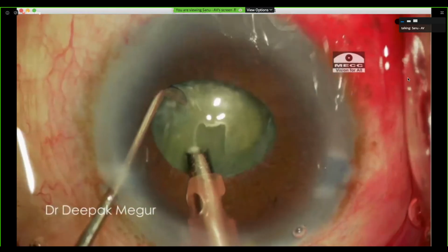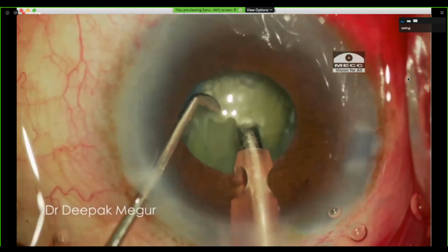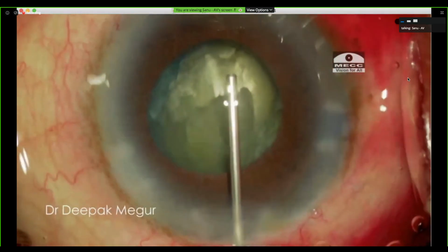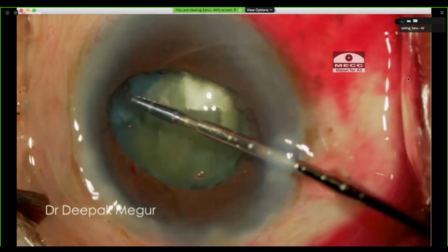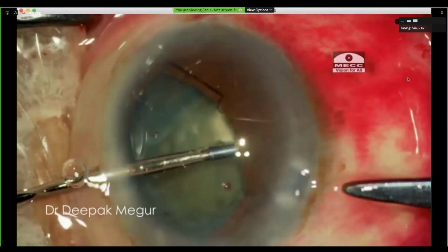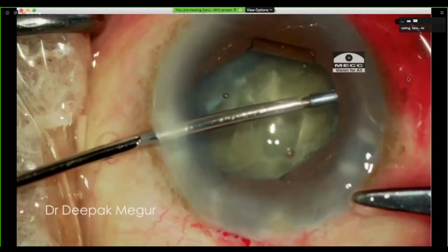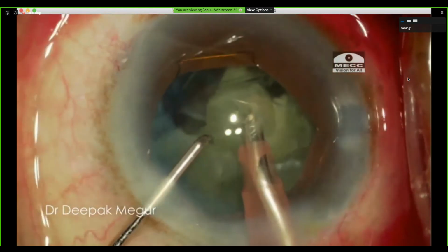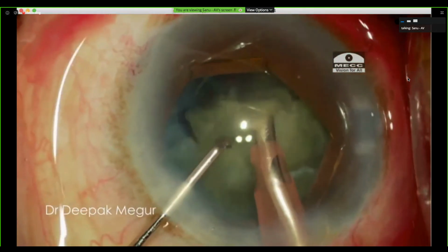Here, the pupil becomes small as phaco is commenced. A little viscoelastic lifts off the iris from the capsulorhexis. The uniplanar design and open notches ensure that the capsulorhexis is not engaged as the flanges are tucked. As the flanges are tucked and advanced, there is instant confirmation. And now we are back to our comfort zone.